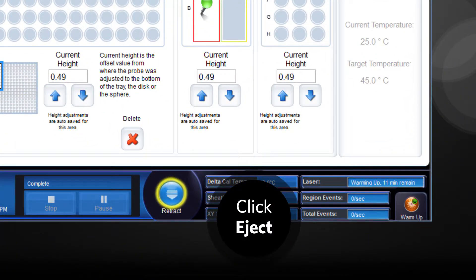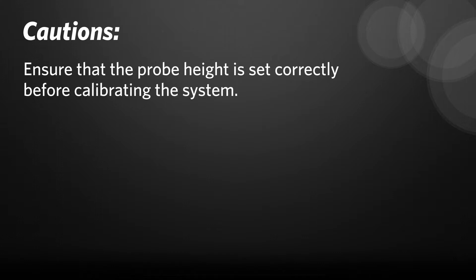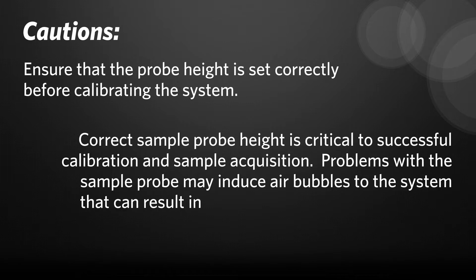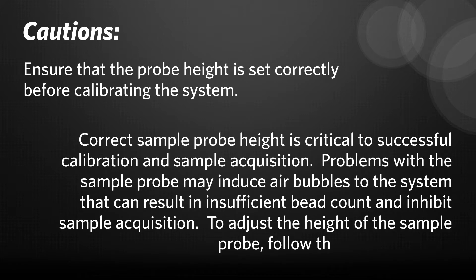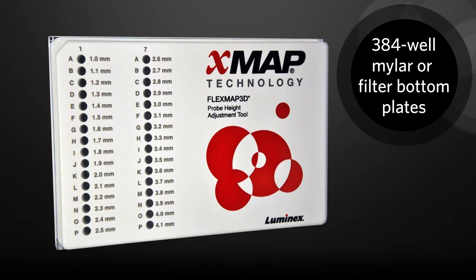Click Eject to eject the plate holder. Remove the probe height adjustment tool and set it aside in a safe place for future use. Please keep in mind the following caution notices. Caution: ensure that the probe height is set correctly before calibrating the system. Caution: correct sample probe height is critical to successful calibration and sample acquisition. Problems with the sample probe may induce air bubbles to the system that can result in insufficient bead count and inhibit sample acquisition. To adjust the height of the sample probe, follow the previous steps. Finally, remember to use the probe height adjustment tool when calibrating the probe height for a 384 well, mylar, or filter bottom plate.